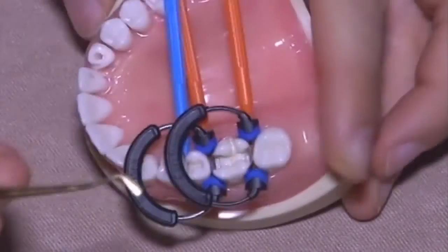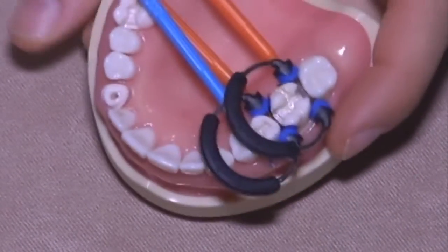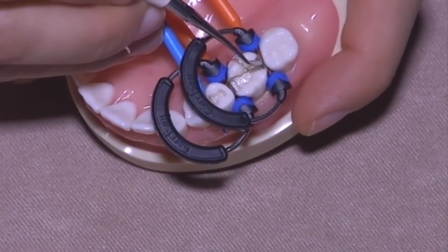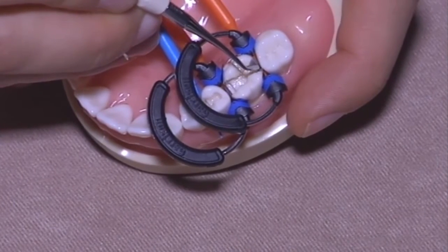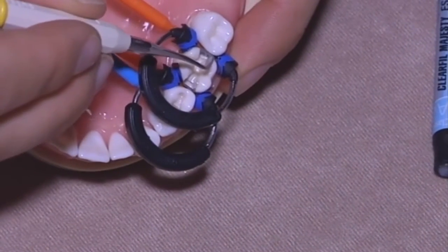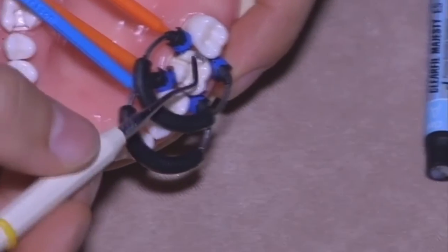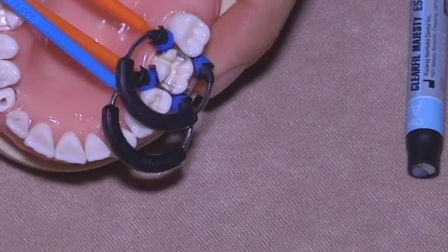You must be gentle in touching the composites in order to let the composites adapt to the cavity. Okay.